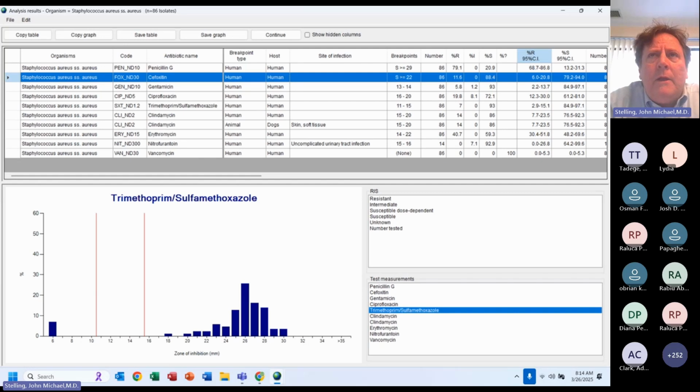I mentioned the clinical impact. On the human side, we see this a few times with meningitis breakpoints and non-meningitis breakpoints. And again, we're not talking about differences in the bacteria's characteristics. It's the same bacteria, like pneumococcus, Streptococcus pneumoniae. That same organism can cause pneumonia, an ear infection, or meningitis.